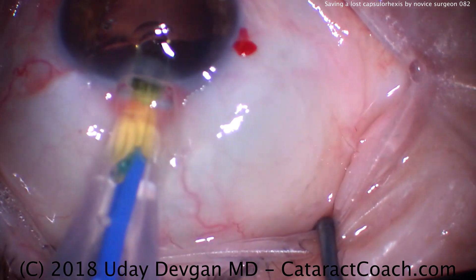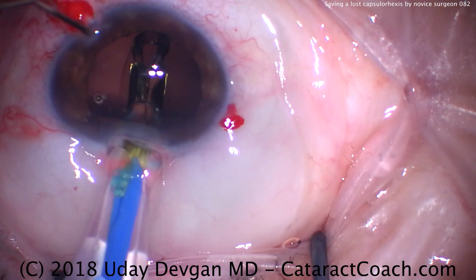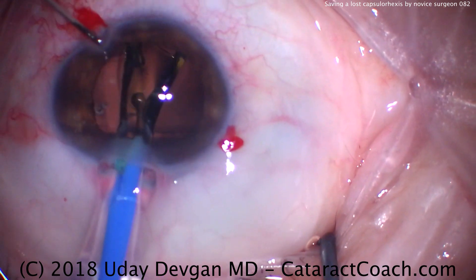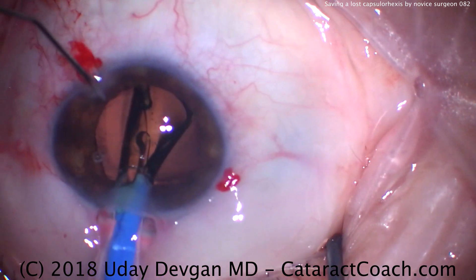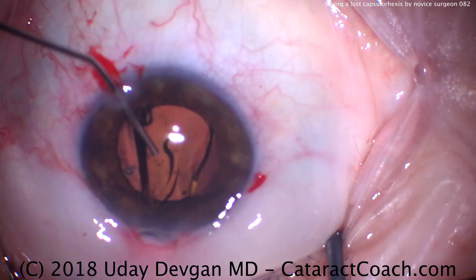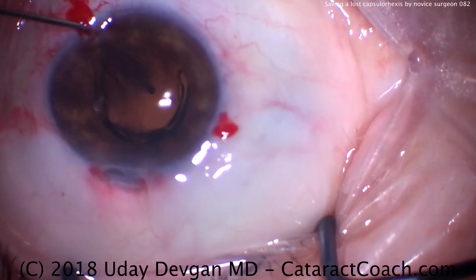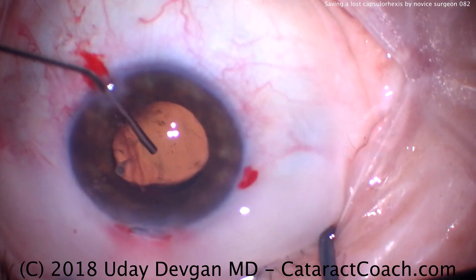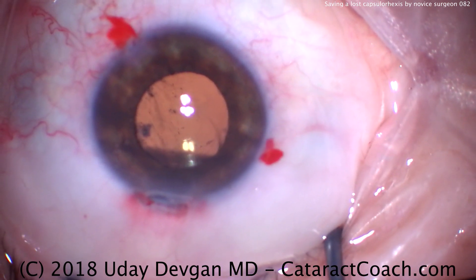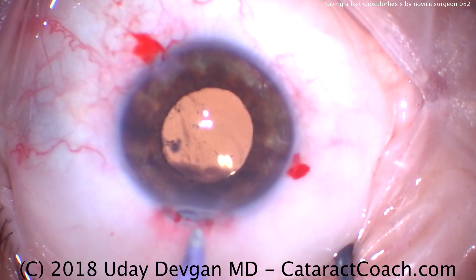Now we're going to insert the IOL into the capsular bag. Taking our time, nice and slow, to push that lens inside the bag. The resident surgeon is sitting superiorly and injecting the IOL. That side port cannula going inside the eye — that's me with the viscoelastic making sure the lens is positioned the way I like it, meaning the entire lens in the capsular bag. That looks pretty good. Now let's remove our viscoelastic from the eye and seal up our incisions.